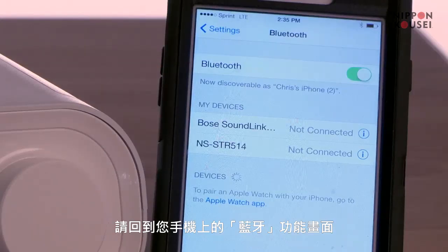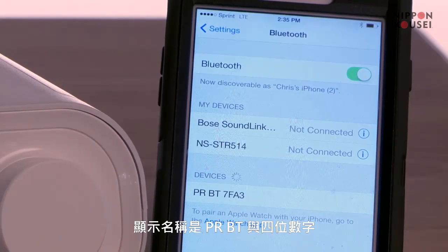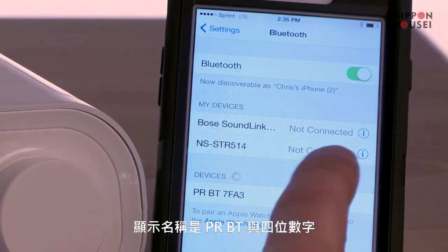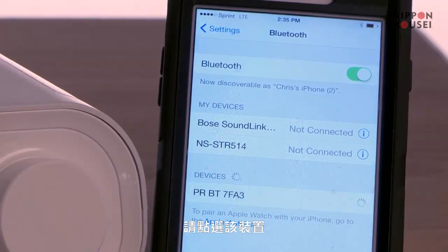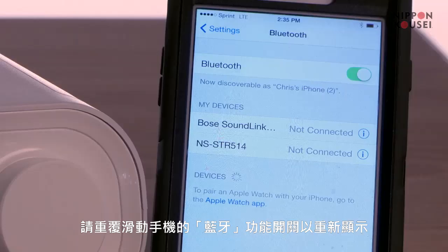Return to the Bluetooth settings on your mobile device. DreamStation now appears in your settings with a name beginning with P-R-B-T, followed by four characters unique to your device. Select that name. If DreamStation does not appear in the menu, repeat the procedure to verify that Bluetooth is turned on.